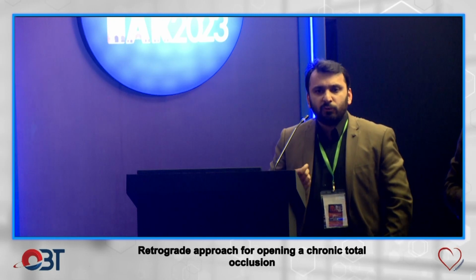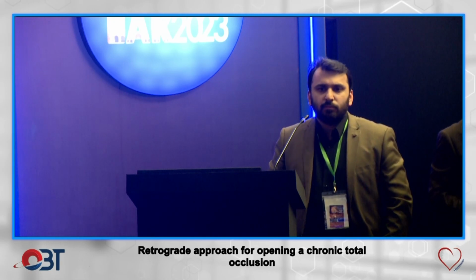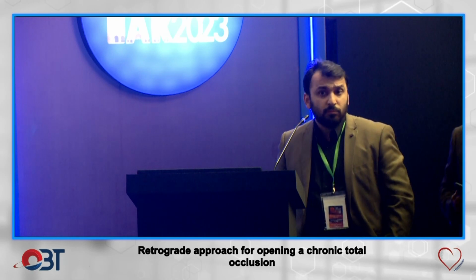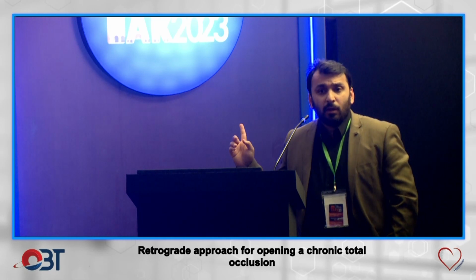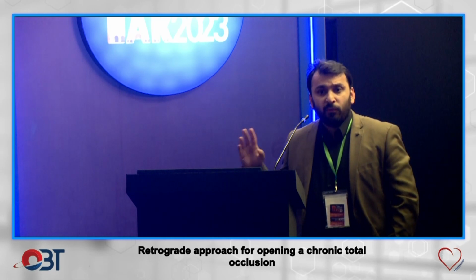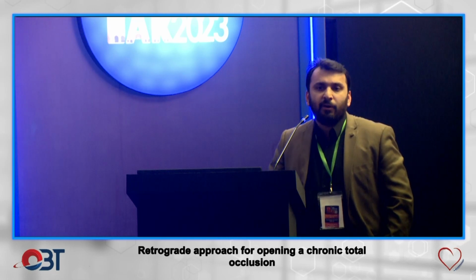When we attempted, if we had chosen the right wire, it has the features of its own, but the Gaia wire could not cross. Have you done any subjective test for LADs? Yes. Any ischemia? An MPI scan was done, which showed severe ischemia in the RCA territory and moderate to severe ischemia in the LAD territory. Okay.